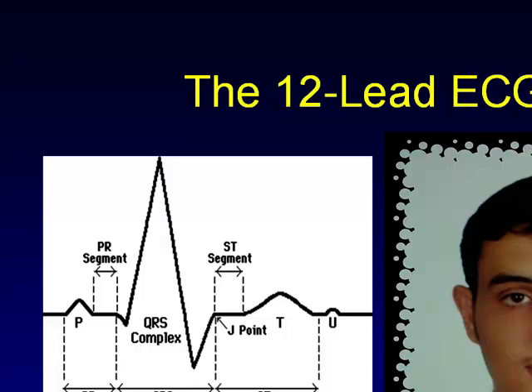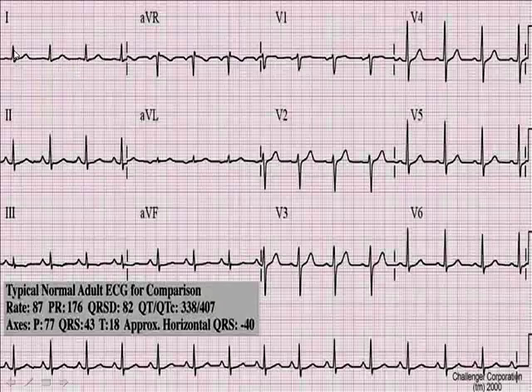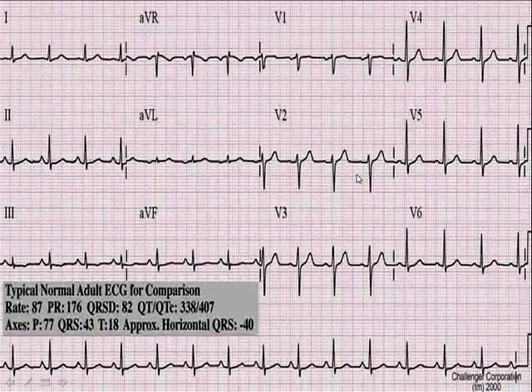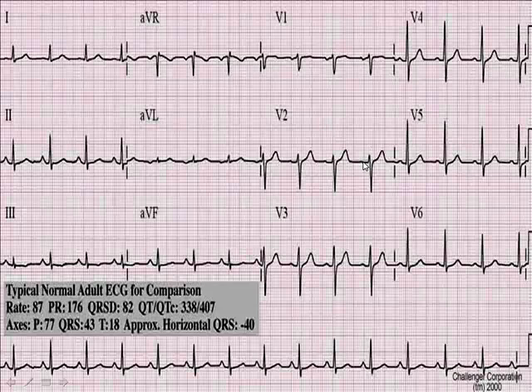But when you go to practice and see the ECG, in reality, it's not like this. It's not just one lead. No, there are 12 leads. Yes: 1, 2, 3, AVR, AVL, AVF, and from V1 to V6. This is very, very hard. You said we only know one. What does that mean, all these leads? This is what we are going to tell you in this lesson. So be careful and listen to us very well, okay?